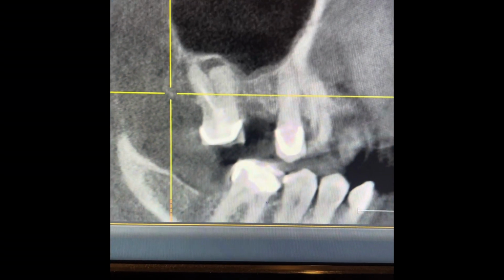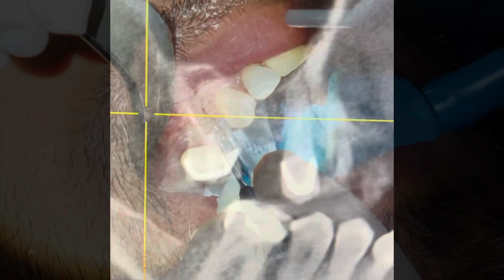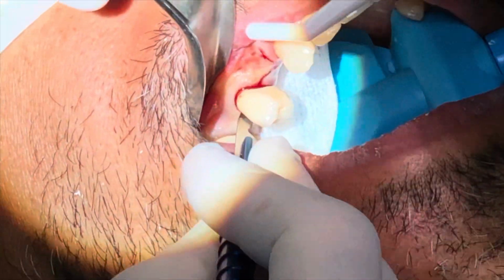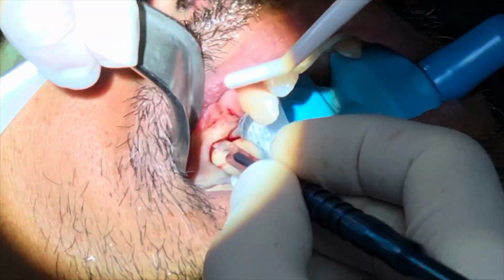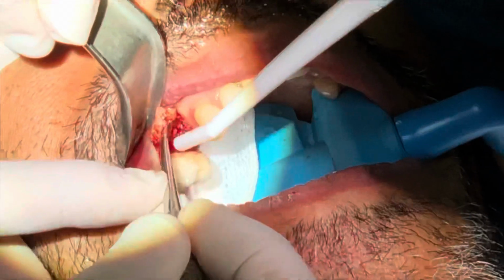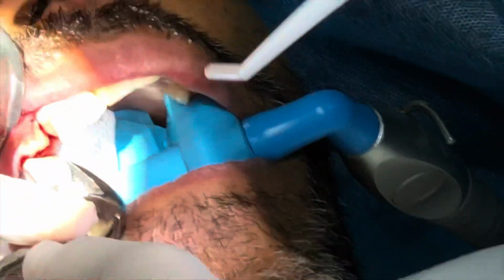This is the 3D scan, or the CBCT, we study beforehand. I use a conservative flap without any extensive vertical release incisions, and I extend it to the tooth I'm going to extract, number 4. This extraction has to be done atraumatically, trying to preserve as much cortical bone as possible.